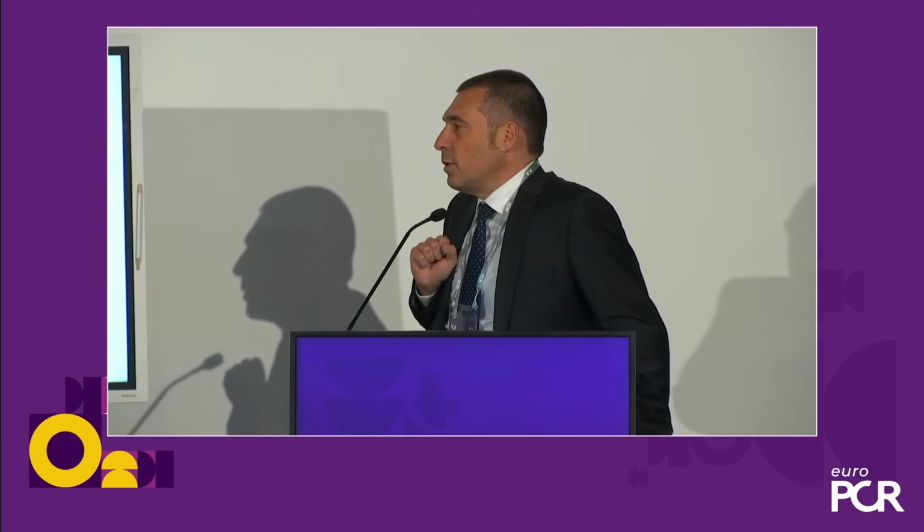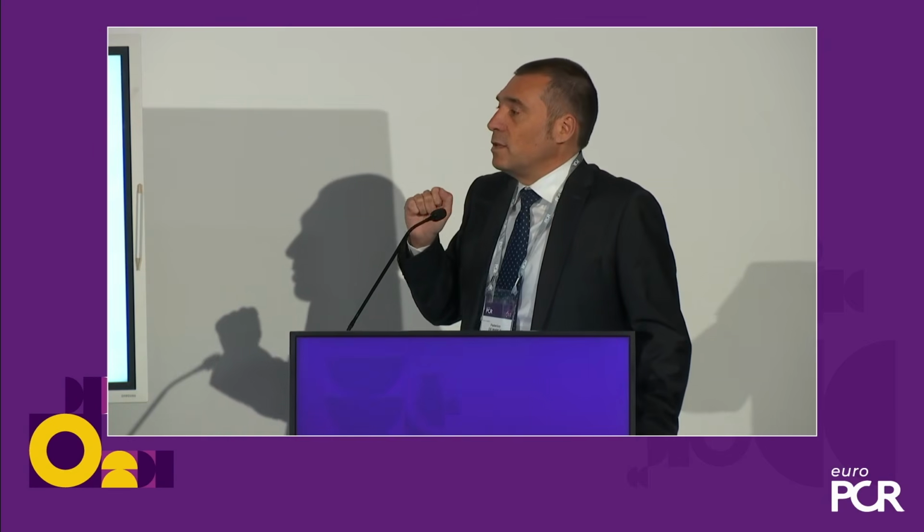Can I add something? I think this is a good message: when you don't have a good transesophageal echo, pull out and use a 4D ICE, but there is some learning curve. We will speak maybe about this later during the procedure. So I think super selective use only in those very difficult cases may pose a problem. So you need maybe to have a lower threshold and use your ICE in most or half of your tricuspid procedures, and that's when it's going to be super useful in those very hard imaging cases.